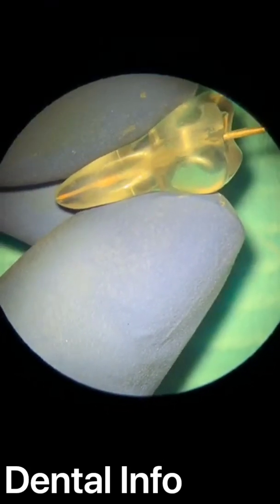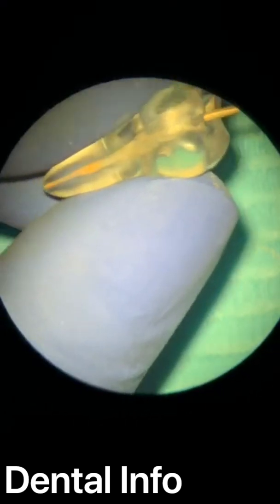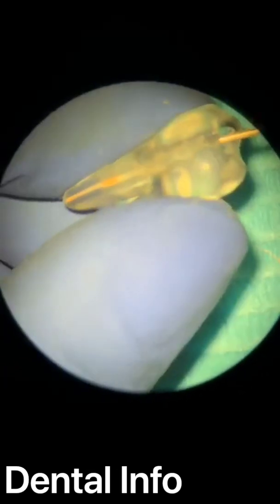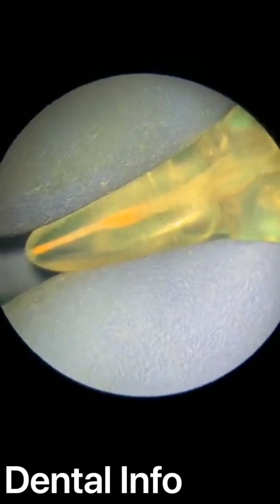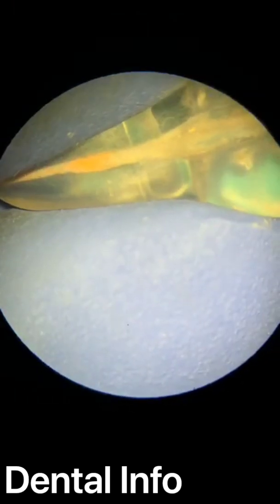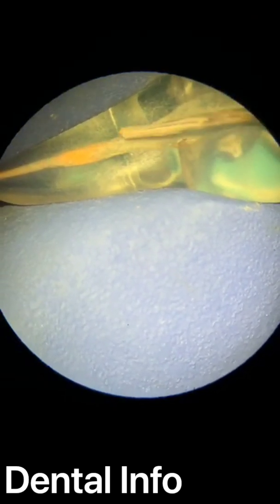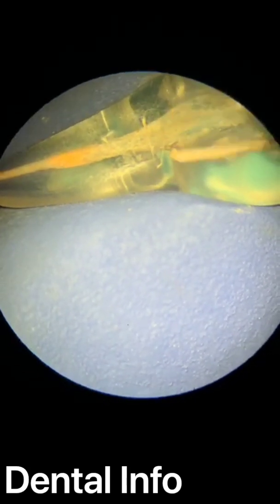I will put the tip until I reach my gutta percha here, and I will press the button. I will magnify for you more. I will press. I recommend here not to fill the canal in one shot. I recommend you to fill it incrementally. For example, 2 millimeters and then another 2 millimeters, another 2 millimeters.